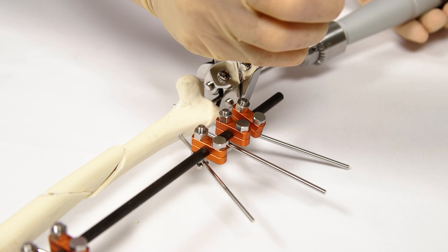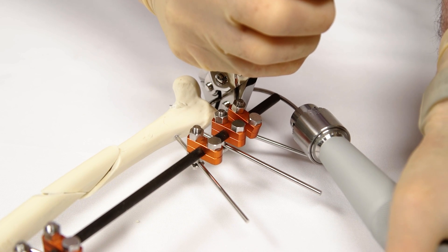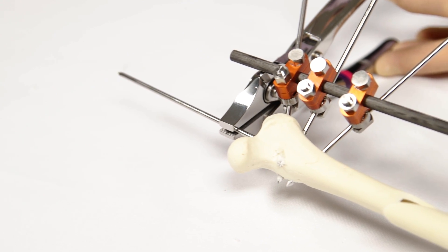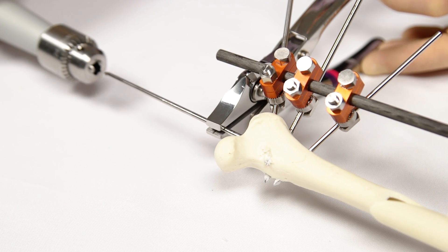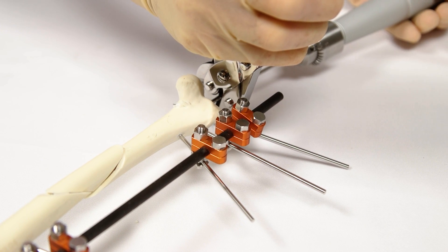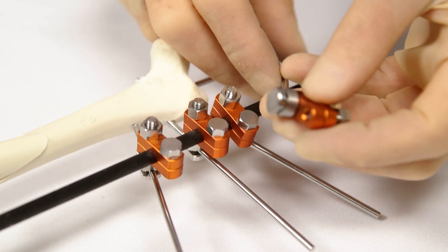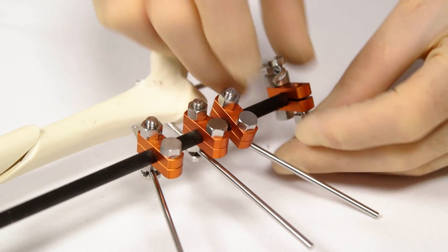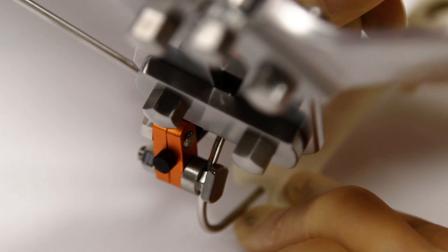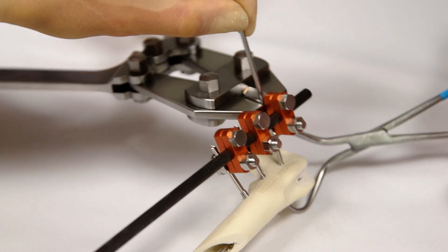Once all ESF pins are placed and all clamps have been tightened, the IM pin is bent laterally from the proximal femur towards the ESF. This is best achieved using a pair of pliers to hold the IM pin where it exits the skin and a Jacob's chuck applied to the free end of the IM pin. Force is applied between the pliers and the Jacob's chuck to bend the IM pin in the direction of the connecting bar. The IM pin is then attached to the connecting bar using a single clamp. The ESF pins and IM pin are cut as close as possible to the connecting bar using pin cutters, and the surgical wound is closed routinely.